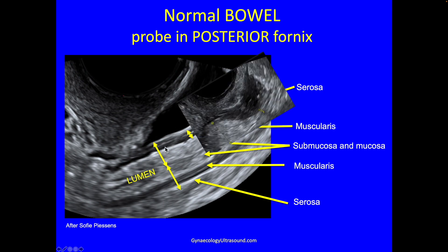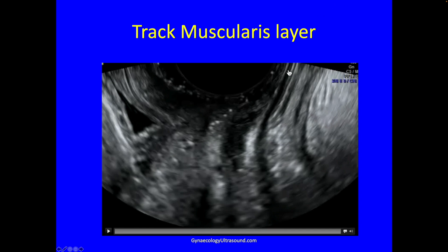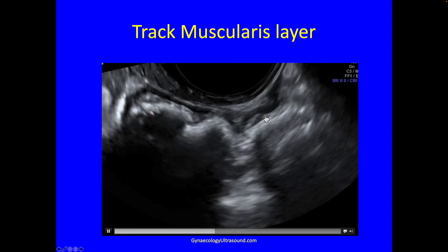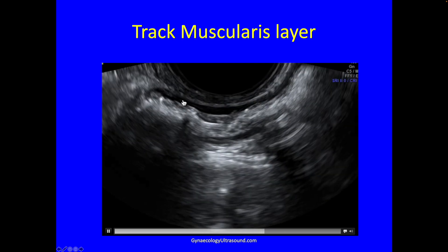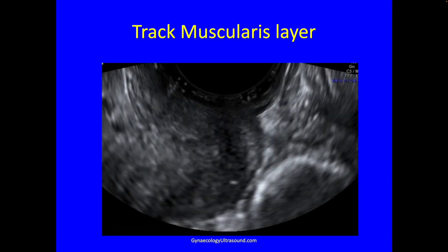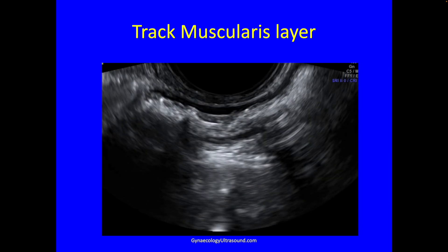The muscularis layer is easily seen because it's a triple layer, and when it's involved with endometriosis it becomes a very dark hypoechoic shape outlined by white tissue — a thick muscularis layer. You withdraw the probe a little bit below the cervix, look for that layer — there's serosa, there's the muscularis — then keep your eye on that layer as you very gently introduce the probe. You can see I'm following it, tracking it through the second rectal curve, and you can often track muscularis up to the uterine fundus but not always.